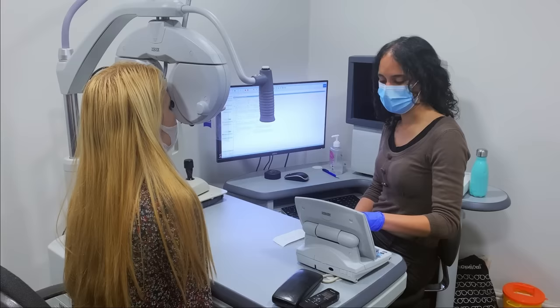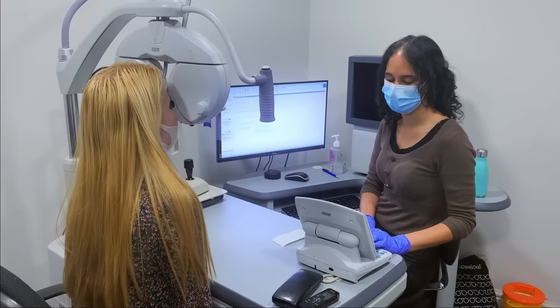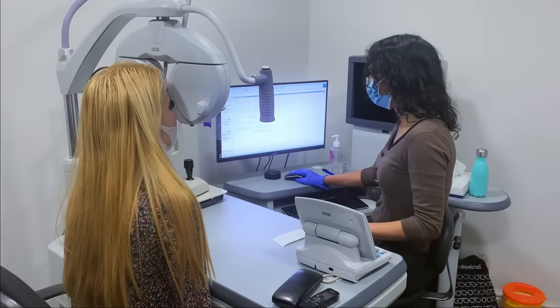So looking back over to the middle line, is it clearer with number one now or clearer with number two? Or are they just the same? The same. That's fine. And then between number three, which is now, or clearer with number four? Number three. Okay, brilliant, good. Lovely, and is the middle line still okay to be there? Yeah, B, F, L, N.